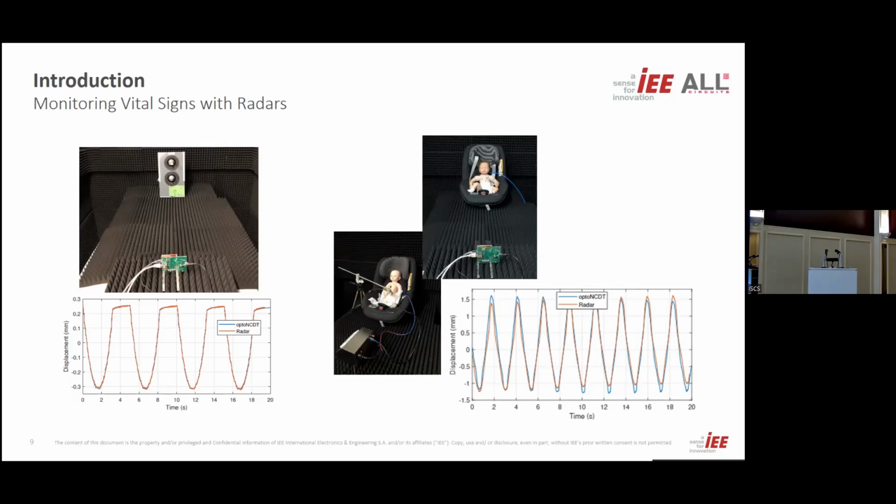This was the laser device here. This is not Vivian that you met in the demo, but Ophelia, our other baby, and we were also measuring how she is breathing. Here you can also see how precise the radar can be. But of course, we are in very specific and perfect conditions in an anechoic chamber, so everything is easier.